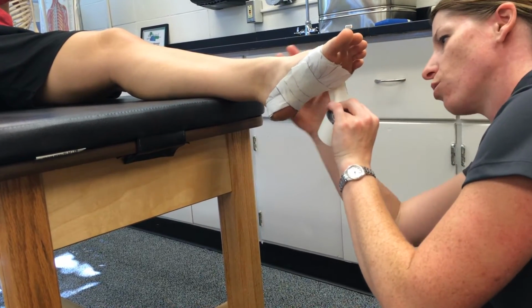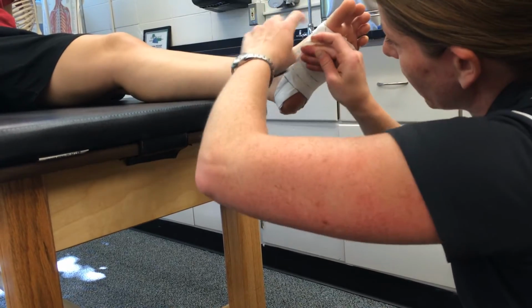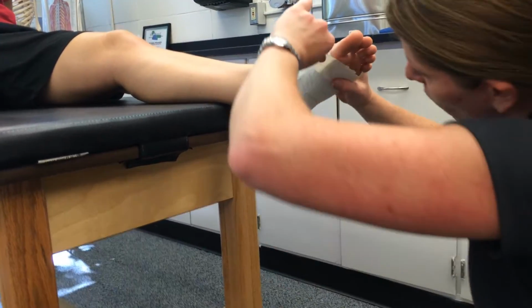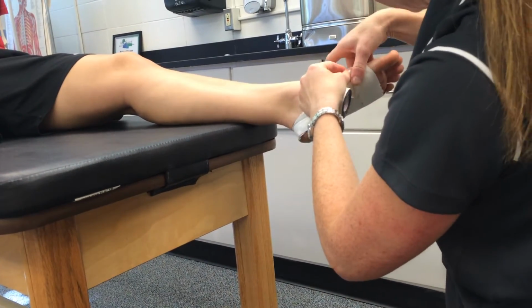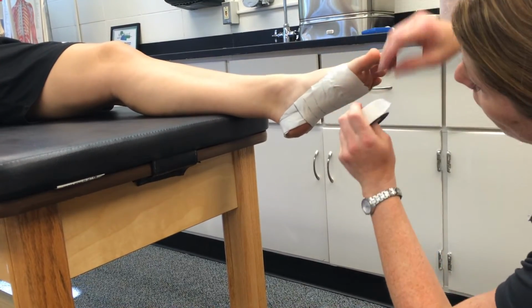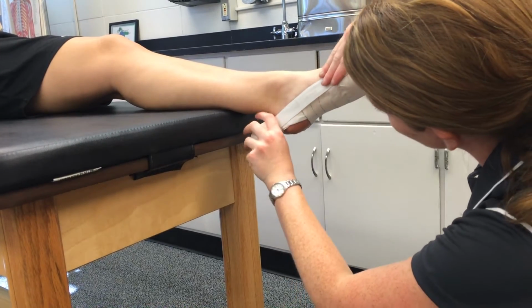Notice I've switched to 1.5-inch tape now. You could do this with 1-inch tape, but it would just take longer because you need a lot more strips because they're narrower. So it's better and faster to do it with 1.5-inch tape. All right, I'm going to switch back to 1-inch tape, and I'm going to cover up all those loose ends at the top.